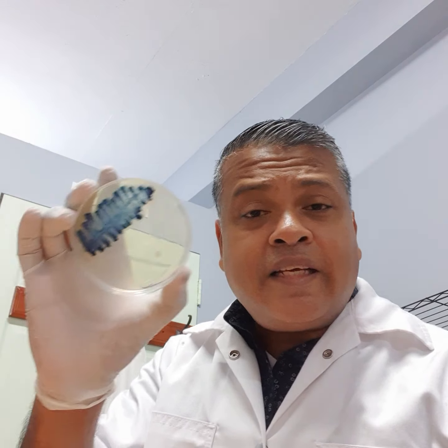of that particular infection. So swabs, urine, any material is taken, inoculated onto these plates, and these plates are then examined.